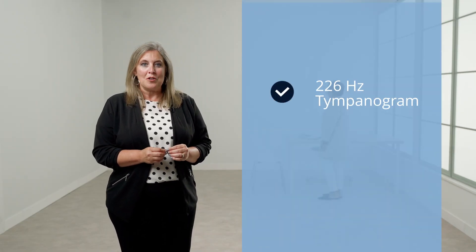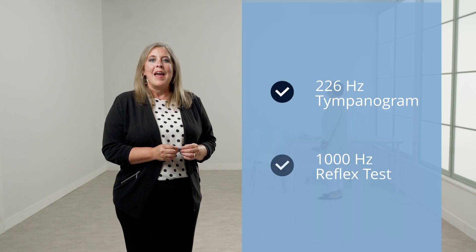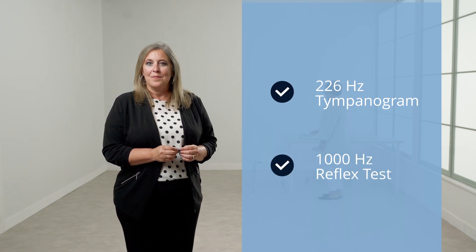The Allegro has a default protocol that includes a 226 Hz tympanogram and a 1000 Hz reflex test. It is possible to change the protocol by entering the configuration menu and following the on-screen instructions to make selections. Follow your facility's guidelines for screening procedures.